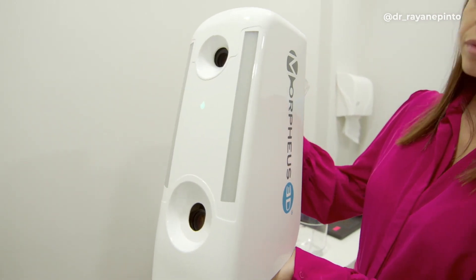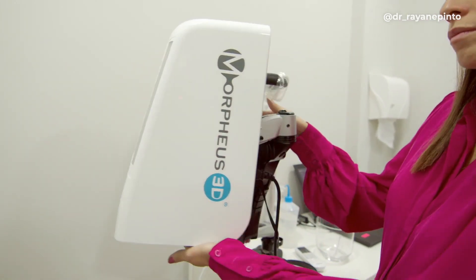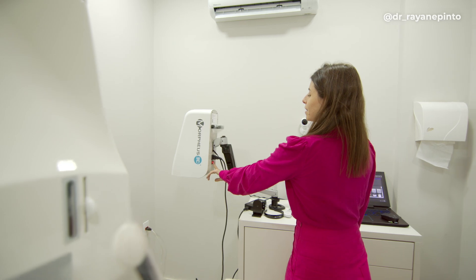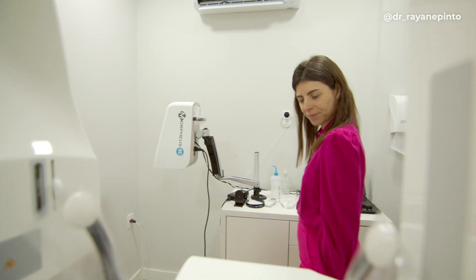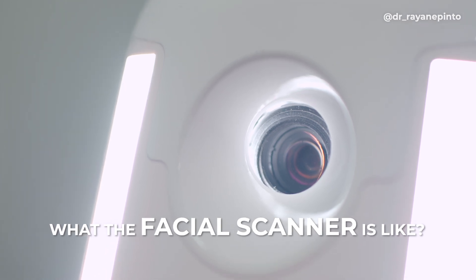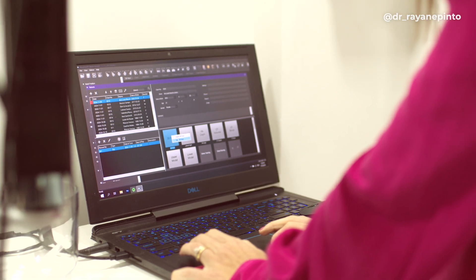Let me show you how the device works. This is the scanner device and it's a bit large because it has to scan the patient. I placed it inside a room where I already had my tomograph. For this facial scanner, you need a white wall so you can scan the patients, and it is always connected to a computer next to it.